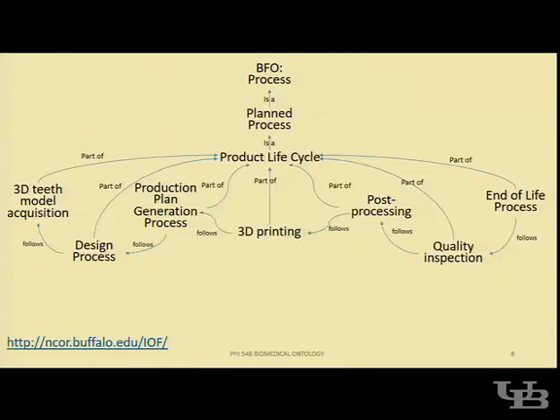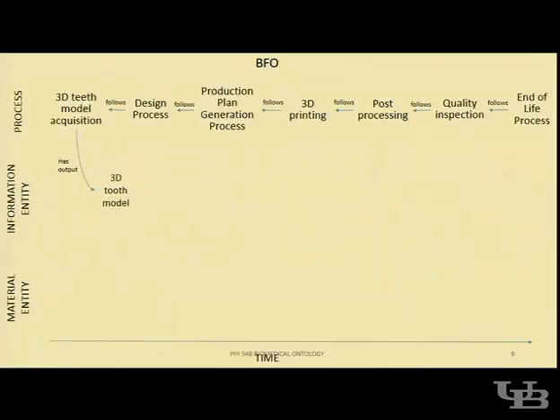So this process precedes another process. After this process will follow another, and so on. I will cover each process one by one. We start with the 3D teeth model acquisition, where from this model acquisition we will have the output, which is the 3D tooth model of the patient.